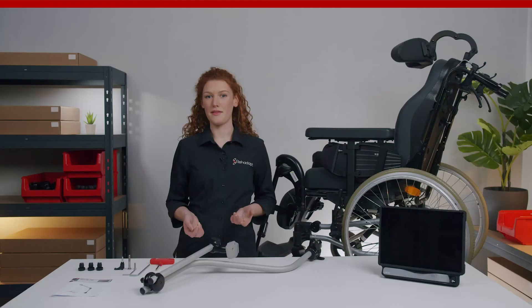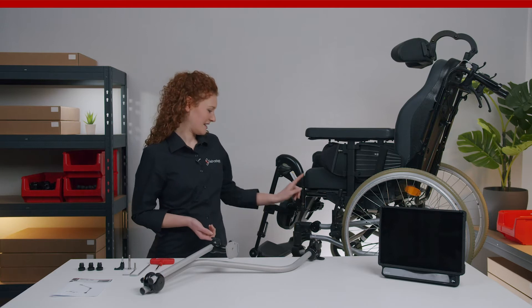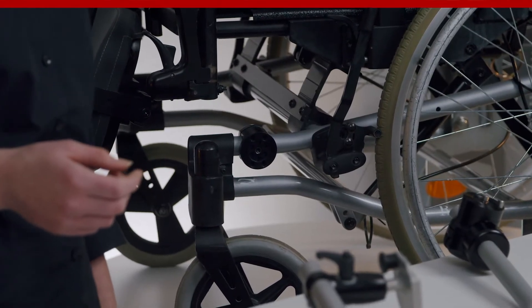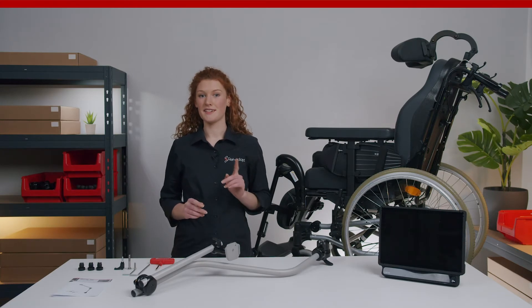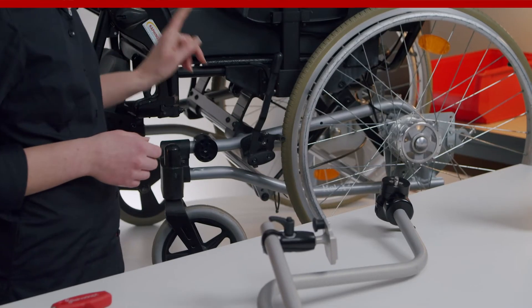Now I will show you how to assemble the M3D curved L bundle correctly on this wheelchair. First we start with the frame clamp. This is the most important part because it creates a base for the mount that is semi-permanently attached to the wheelchair. There is a frame clamp for every wheelchair, but it's not included in the bundle so you have to order it separately. For this wheelchair we need the RKL 25.